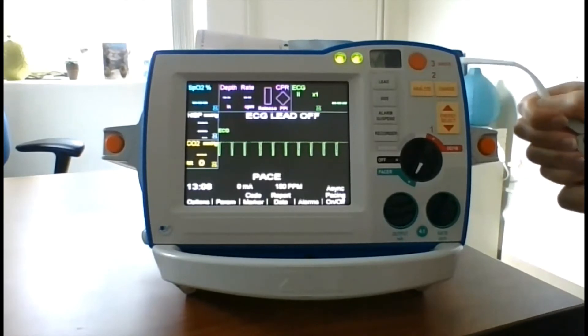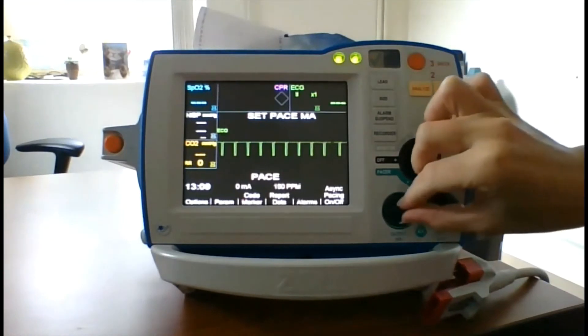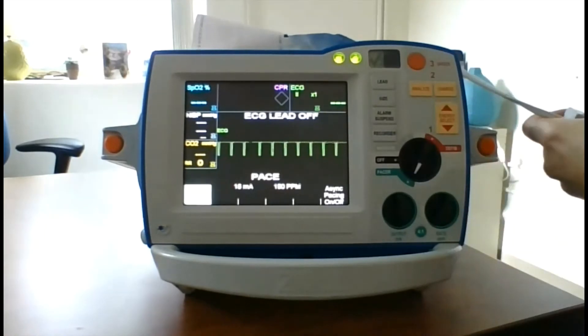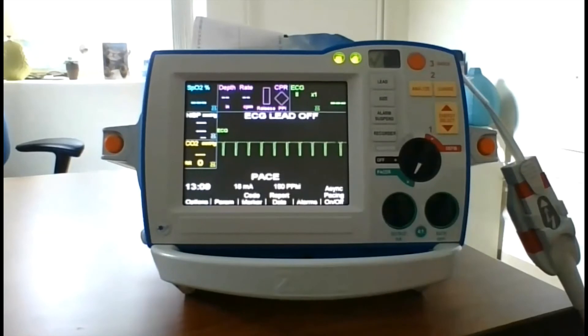Next, ensure the pacer output is set to zero. Disconnect the cable from the pads or test port. Slowly turn the pacer output control to 16. The message 'check pads' and 'poor pad contact' will appear on the screen. The pace alarm will sound and the clear pace alarm soft key flashes. Reconnect the cable to the pads or test port, then press the clear pace alarm soft key. The messages should disappear and the alarm will stop.